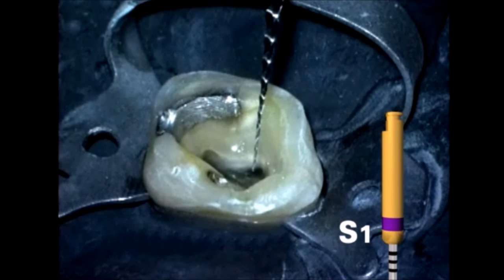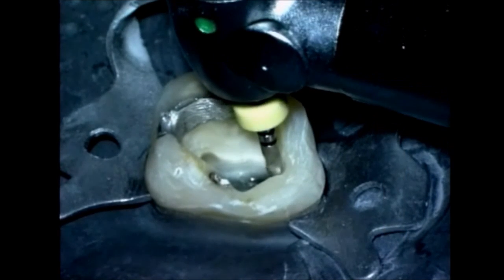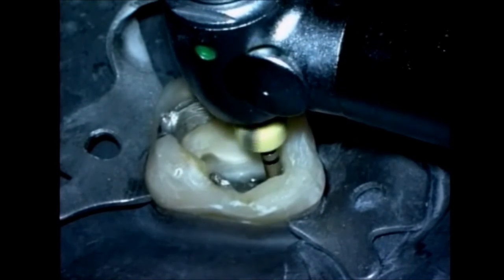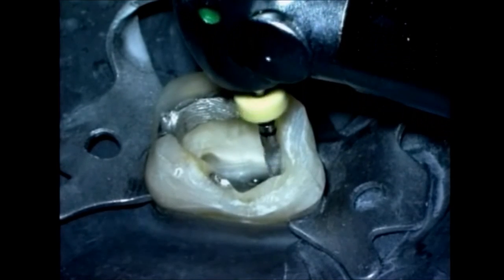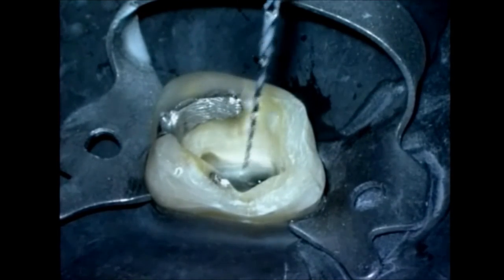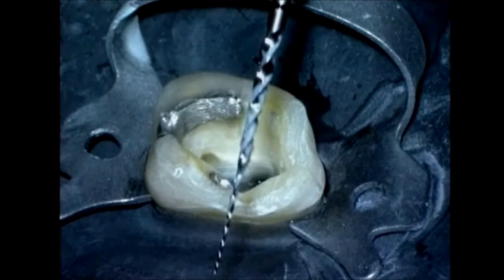Shaper number 1 follows the use of the Scouter files and can be introduced whenever we have a smooth and reproducible glide path. Let the instrument float down, and when the rubber stop is just short of the reference point, the instrument is withdrawn. We can observe the debris on the flutes, and it can tell us quite a bit about where the instrument's actually cutting in the canal.